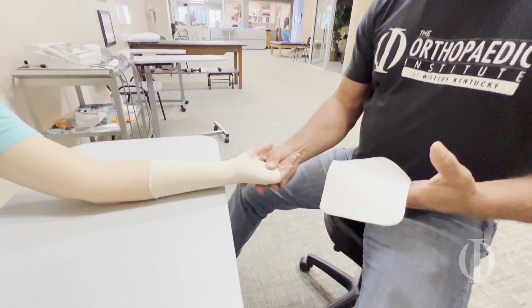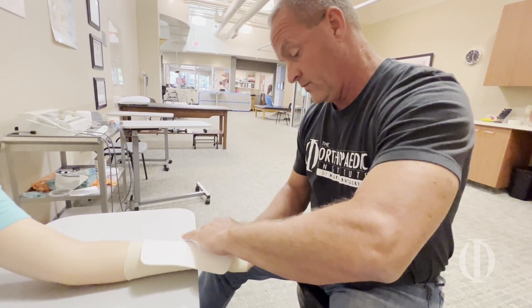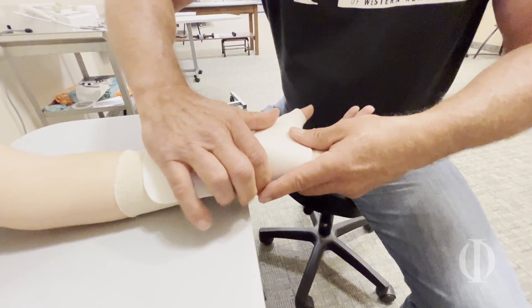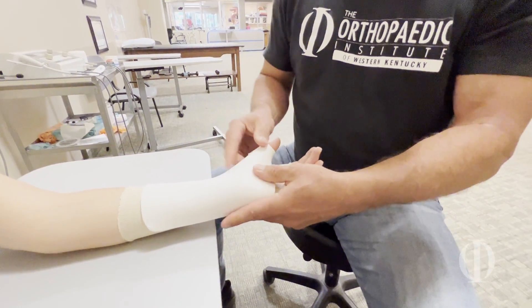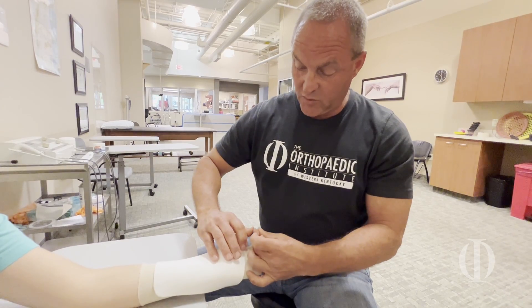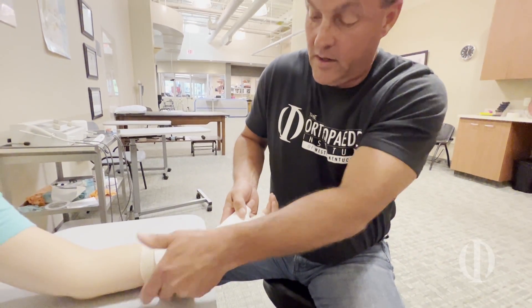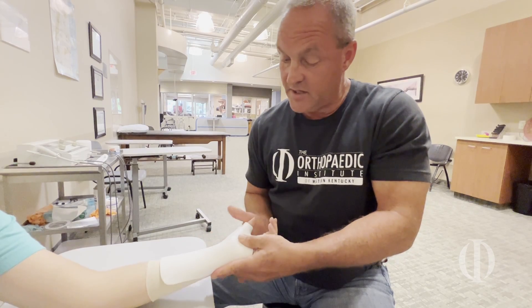I like to position the patient where the wrist is hanging over the edge so we can get a little bit of wrist extension. We're going to wrap it around the thumb first, and we want to make it so that the IP is able to flex. Then we're going to form the plastic to the rest of the wrist and hand. Sometimes you like to have the thumb in radial abduction, but a lot of times we like to have it positioned halfway in between so you can do a little bit of opposition and at least be able to do some functional activity with your splint on. It takes about two or three minutes for the plastic to firm up — you don't want to squish it, you've got to kind of pat it on.